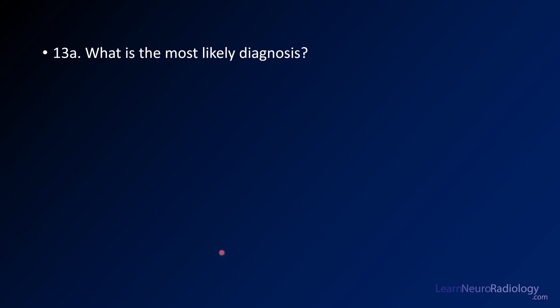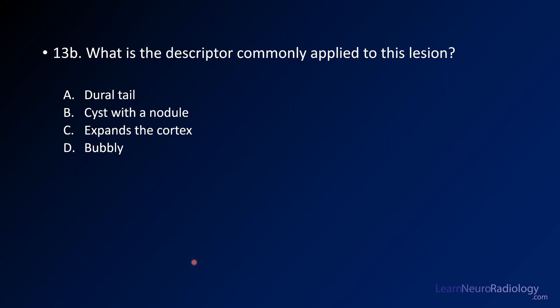The patient has seizure-like symptoms and kind of an ill-defined abnormality in the medial temporal lobe. Your second question is: what is the descriptor commonly applied to this lesion? Does it have a dural tail? Is it a cyst with a nodule? Does it have cortical expansion? Or is it bubbly?